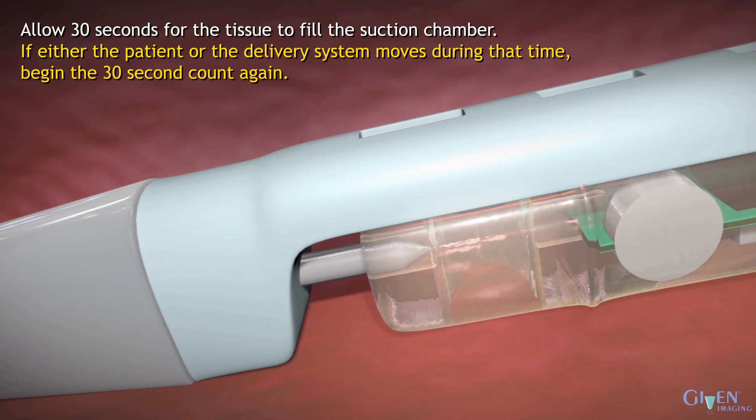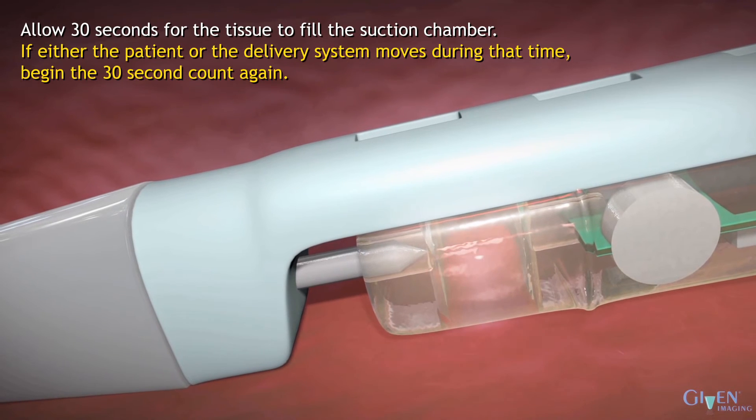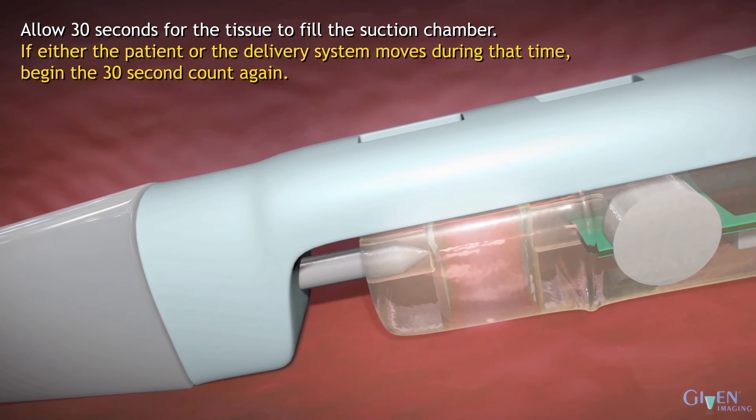Allow 30 seconds for the tissue to fill the suction chamber after the vacuum level of at least 550 mmHg has stabilized. If either the patient or the delivery system moves during that time, begin the 30-second count again.